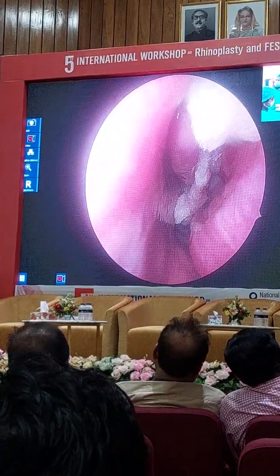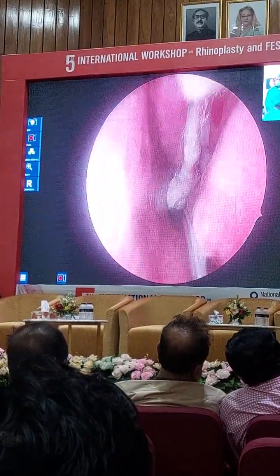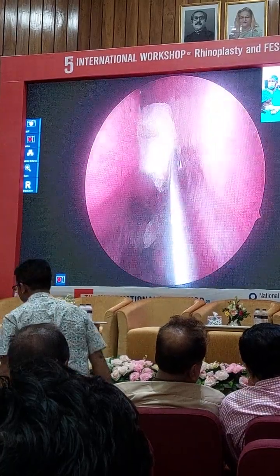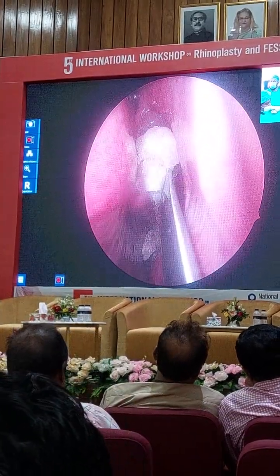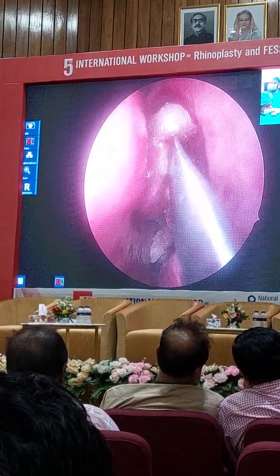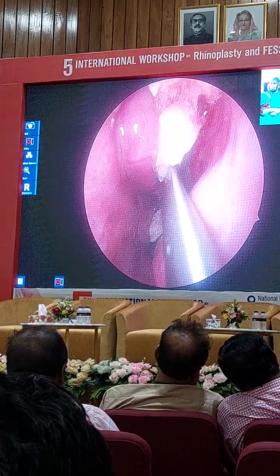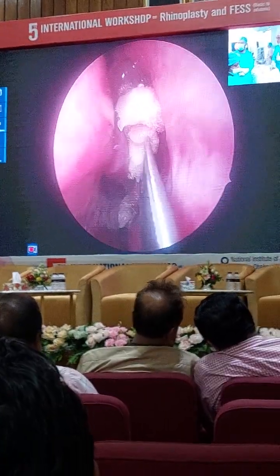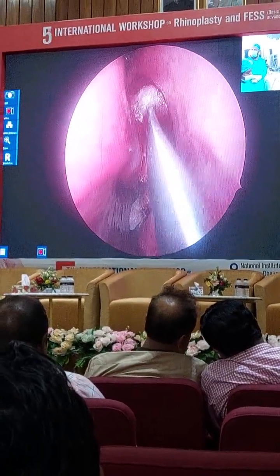It also opens up your meatus, middle meatus. So now you can get a little more working space here. I'm also going to do a soft fracture of that middle turbinate, just with the patty, to have it as medially as possible. And with a soft fracture, you're not worried of a CSF leak because the mucosa is intact.